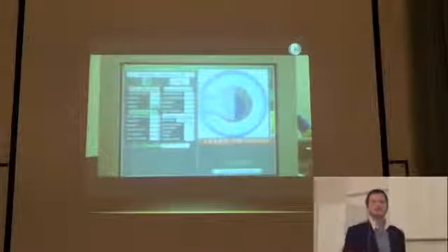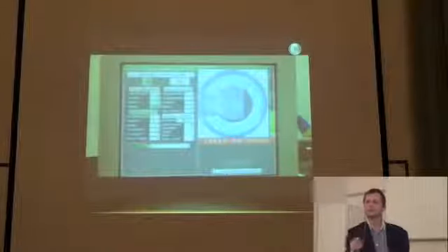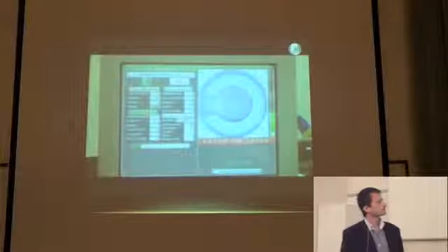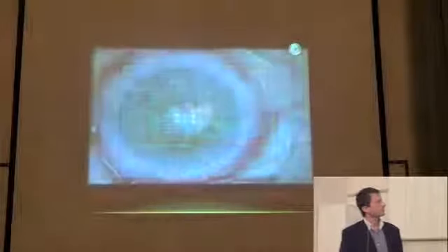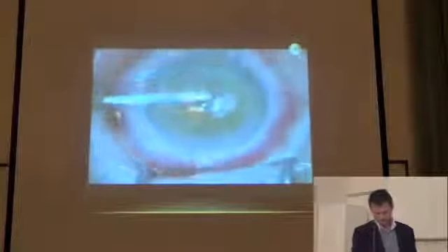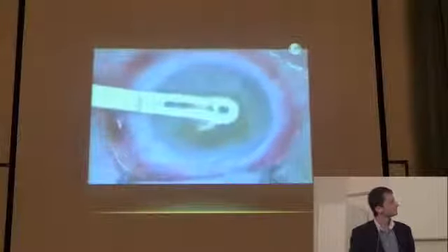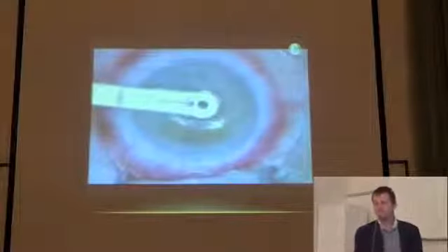But if you have another femtosecond laser, maybe Ziemer, it's not the same cone operation. So I don't know how you can do with another femtosecond laser. So you find the ring, you prepare the pocket. Now it's almost the same for the procedure. And you insert the FlexiView. It seems to be easy too.